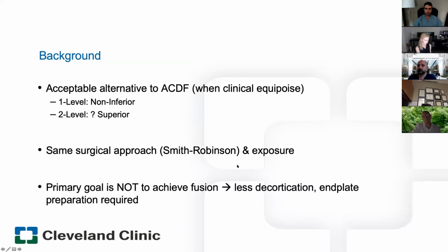And there's really not too many nuances that are different. It's more the lack of end plate preparation. Remember, you're not trying to get a fusion here. You really have to keep things kind of intact, and you have to really pay attention to taking down the PLL posteriorly and not drilling too much, especially in the inferior or posterior half of the vertebral body in the presence of a large disc osteophyte.